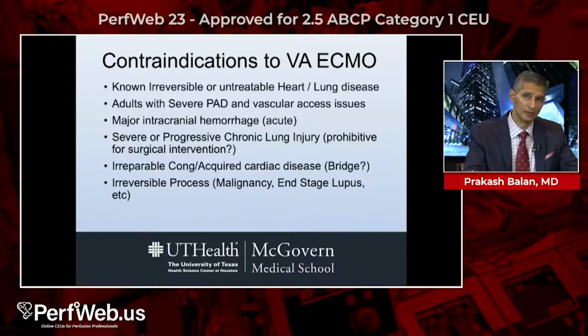Now, so far we've talked about the reasons to put a patient on. When should you not put a patient on? When you're dealing with irreversible or untreatable heart-lung conditions, there's no point in putting a patient on that bridge to nowhere. Severe vascular insufficiency, oftentimes patients with advanced vasculopathies are not going to be candidates for permanently implanted VADs or transplant, and therefore you should not put them on temporary support.